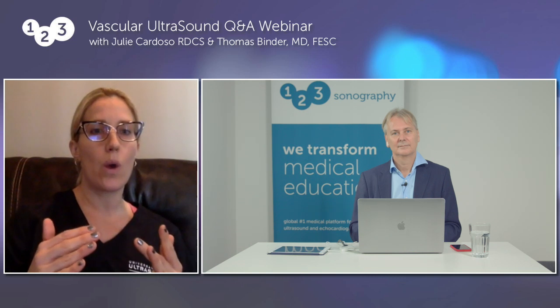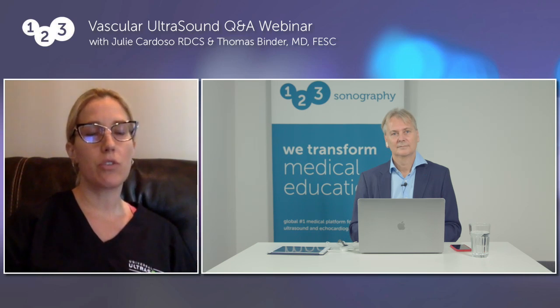And then you also want to mention the phasicity of the venous flow. So you want to note that in the deep system, the venous flow is phasic and varies with respiration. Because when we assess venous flow, a difference in the phasicity can indicate obstruction either above or below where we're at, or insufficiency. So these are all clues that you want to put in your report. So you want to identify the B-mode imaging of these vessels and the Doppler.